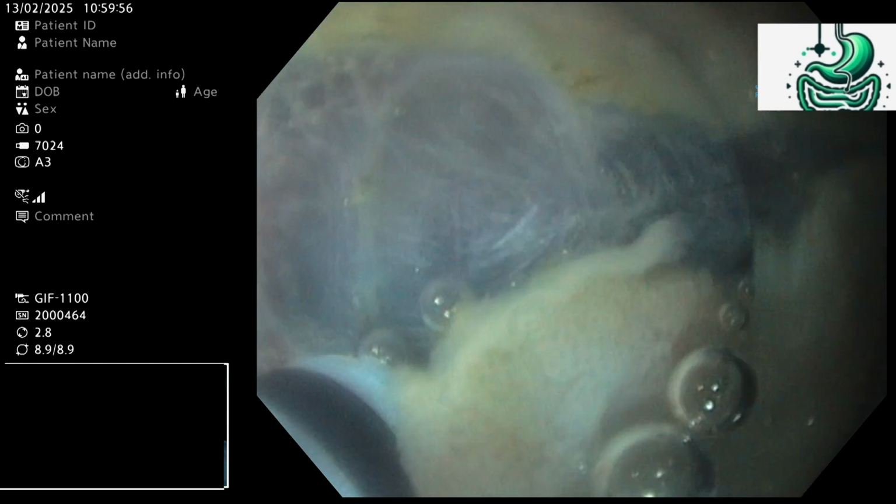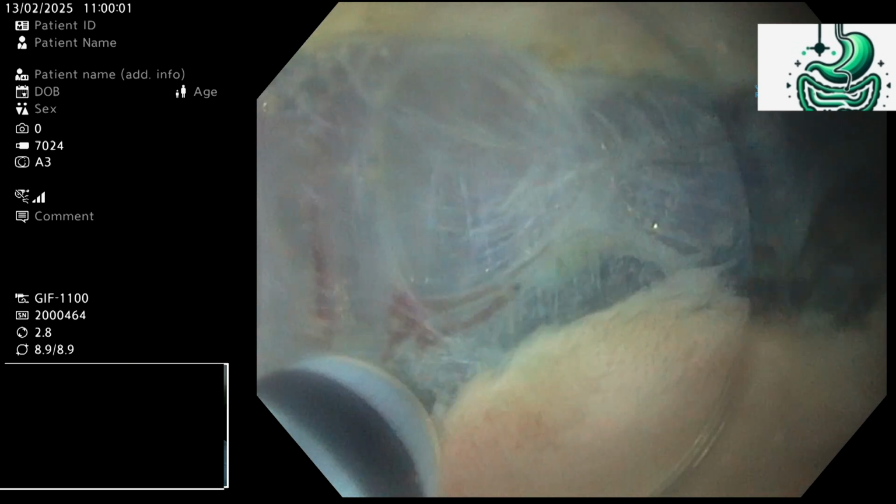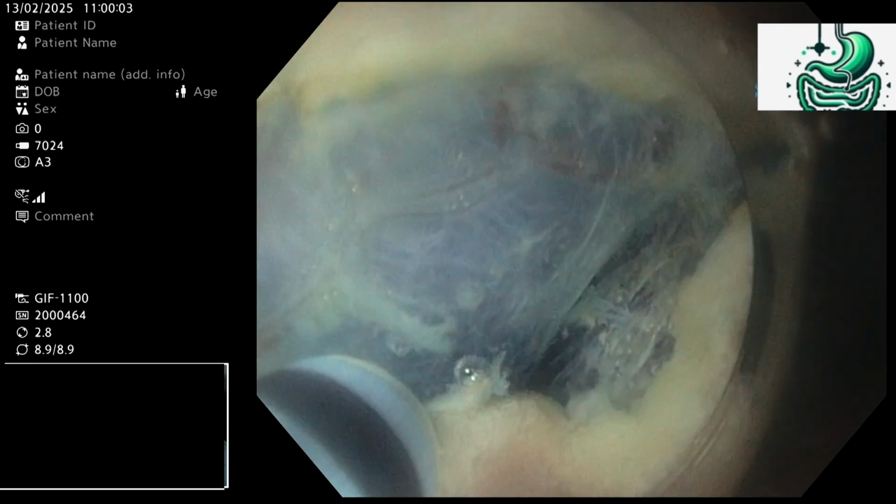Any other question from the audience? Is the pump using saline or is it water? Because that's a very important thing. Saline. Good. We have asked for saline.